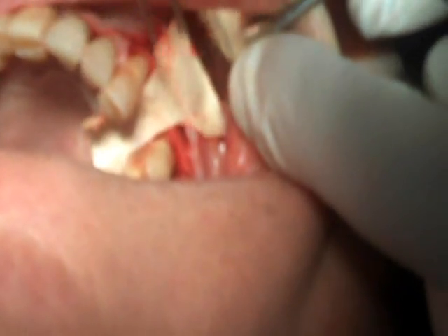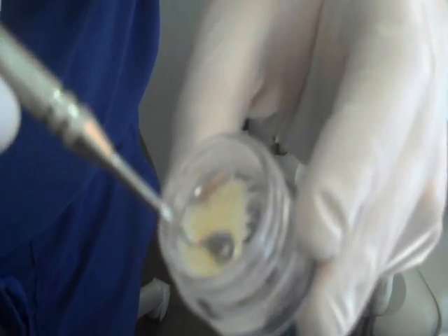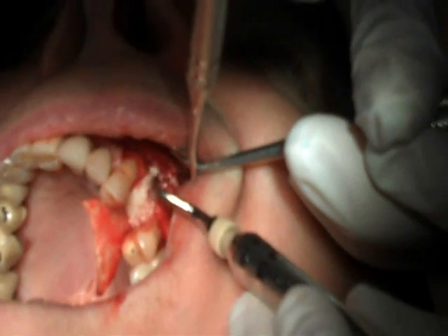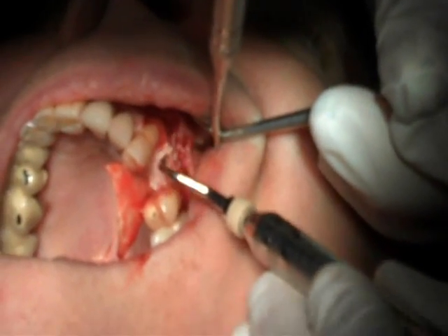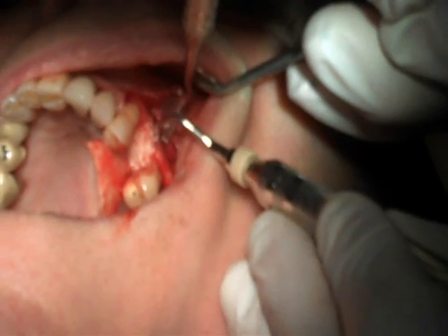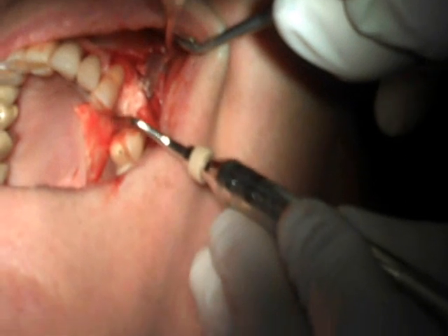I go ahead and place the graft. This is the graft material — human-derived tissue. When it gets incorporated into the area that I'm placing it, most of it should turn over into normal living bone. I'm now placing the graft material into the defect and I pack it. You can appreciate how there's total loss of bone structure on the cheek side.